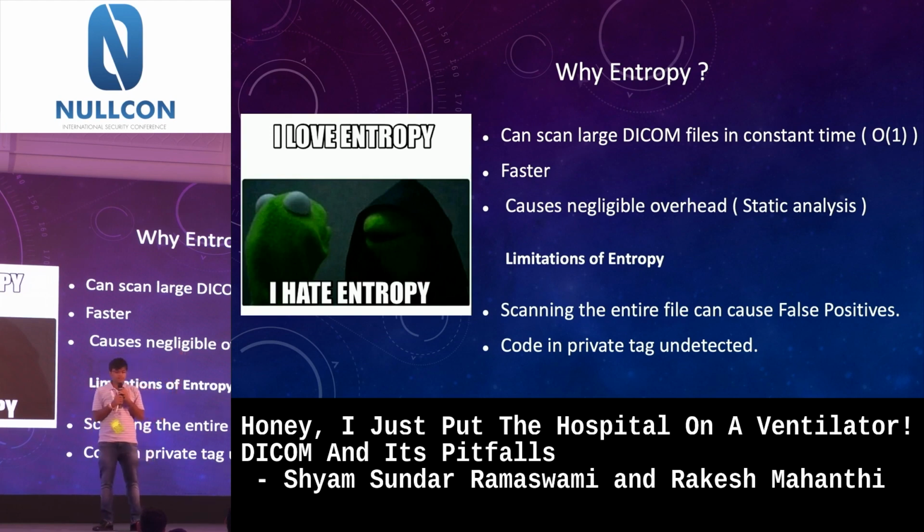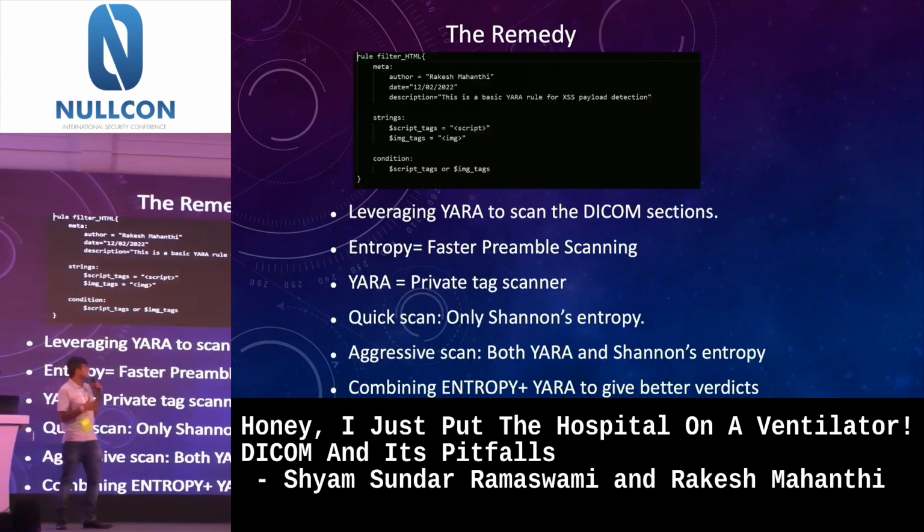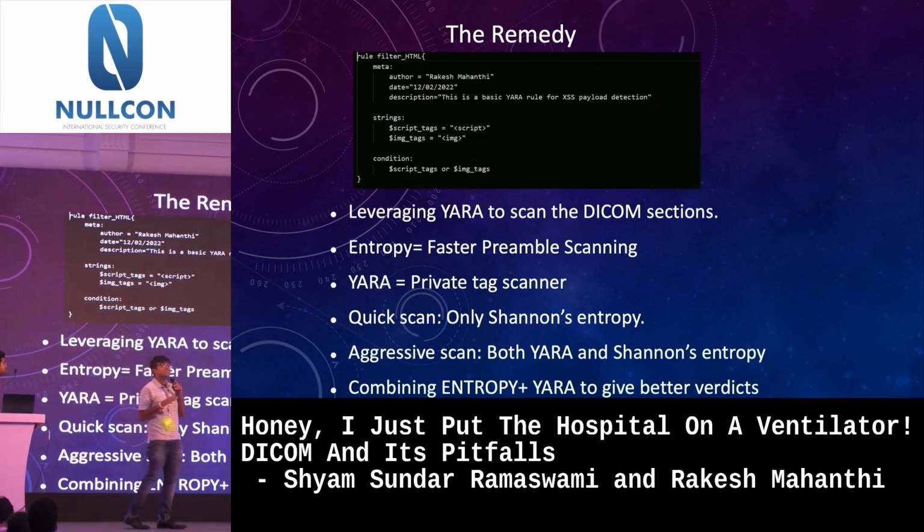Another thing is, not just the Windows scripts, you can put certain Linux commands like nc calls and other things into the preamble section. 128 bytes is huge, dude. You can put a lot of Linux scripts into that particular section of the DICOM file. So all these things will go under the hood when you use entropy. So that's the reason why we decided to go with another layer of security, which is using Yara.